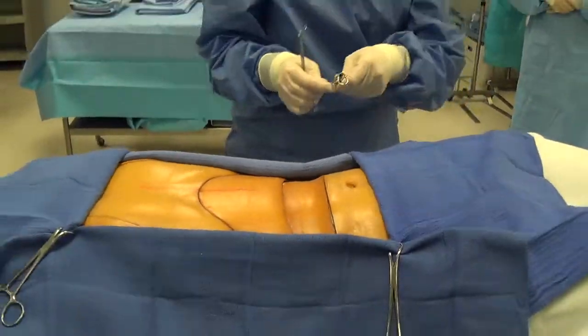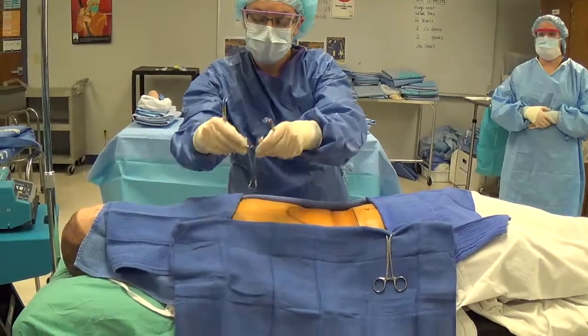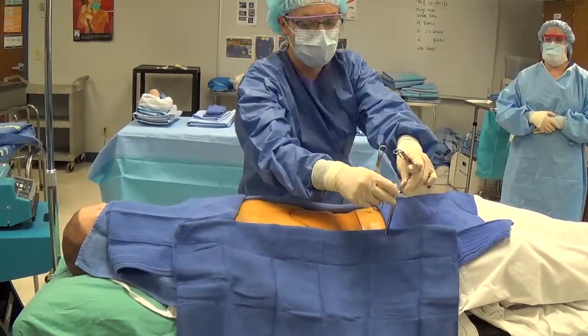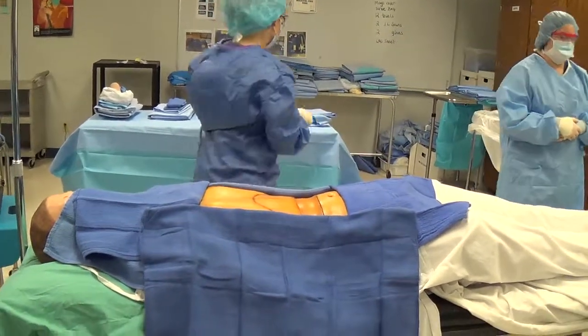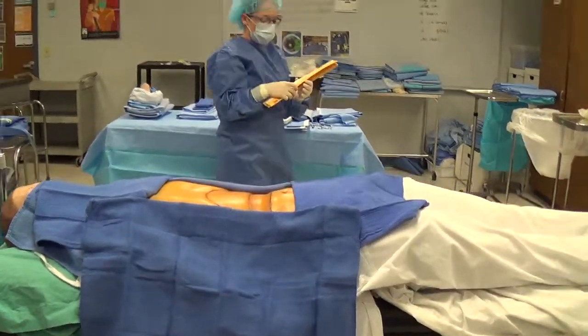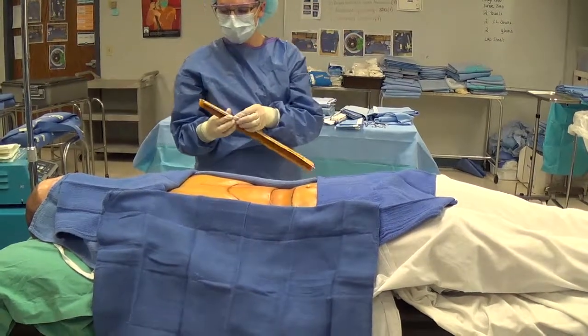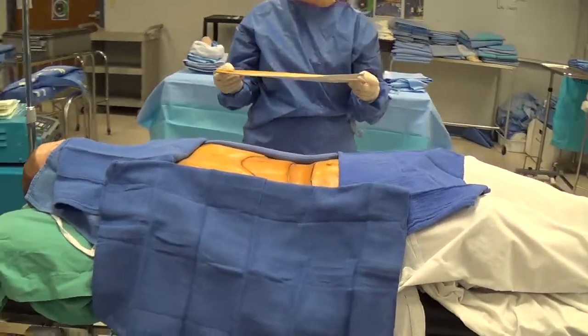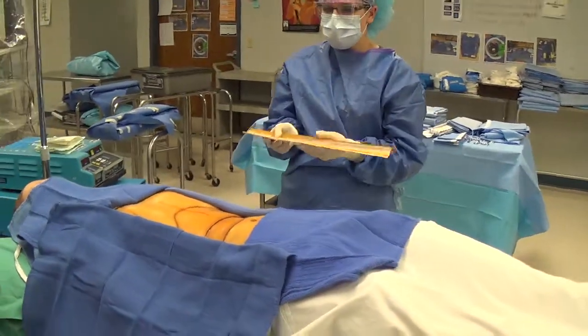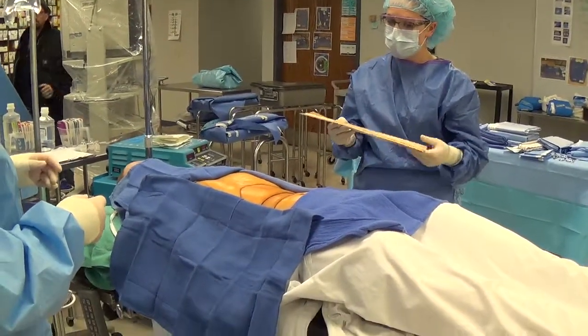If your surgeon is placing an Ioban over the top of the towels instead of perforating towel clips, it would be placed in this fashion. The Ioban is a sterile drape impregnated with an iodophor that is slowly released throughout the case and helps prevent the regrowth of microorganisms. We like Iobans because they lock microbes on the skin and prevent bacterial migration into the wound.